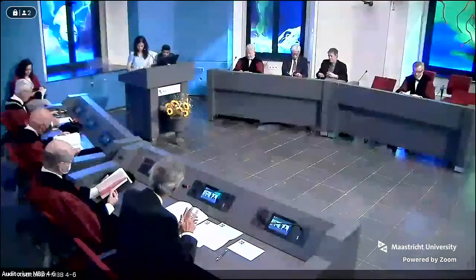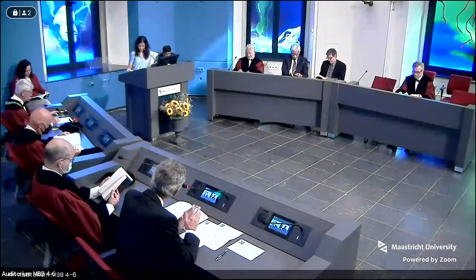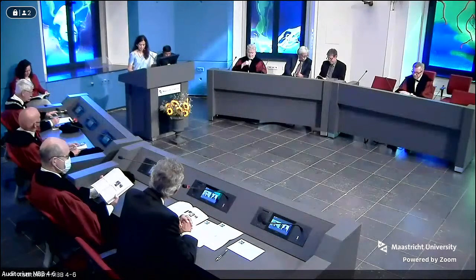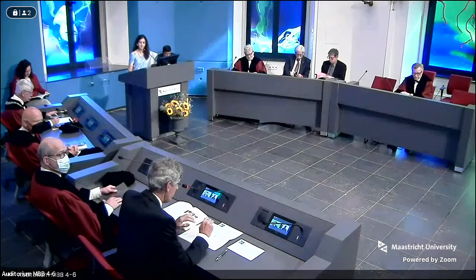Still, there are questions that we would like to have answered, of course. And one of the questions, I take you to chapter 8 on page 87, and we go to table one on page 92. You correctly do a correction of your measurements with the OCTA for the signal strength, because increased signal strength will increase your vessel density and your perfusion density also. So you're correcting for that.